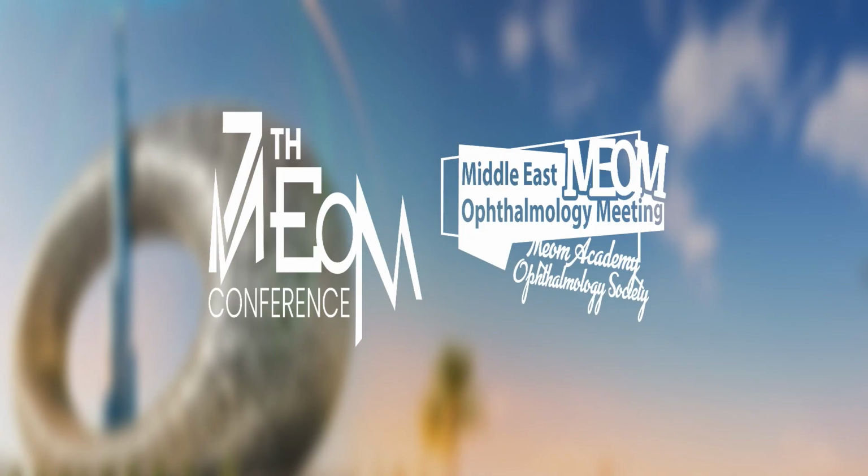We are not talking about OCTA alone, because if you want to treat the patient, whether there is ischemia or not, yes, OCT angiography will answer the question. But whether there is an edema or not, OCT angiography will not answer that question if the edema is not involving the fovea and there is no cyst. So combining structural OCT plus OCT angiography really replaces fluorescein angiography in real life practice in 99% of cases. About the periphery, the upcoming wide field will solve this problem. But again, in the macular area, I think structural OCT and OCT angiography are replacing fluorescein angiography.